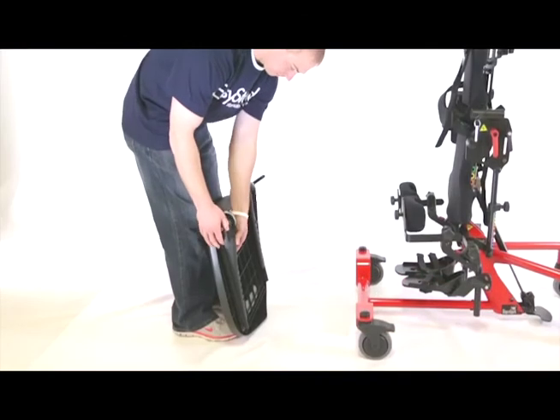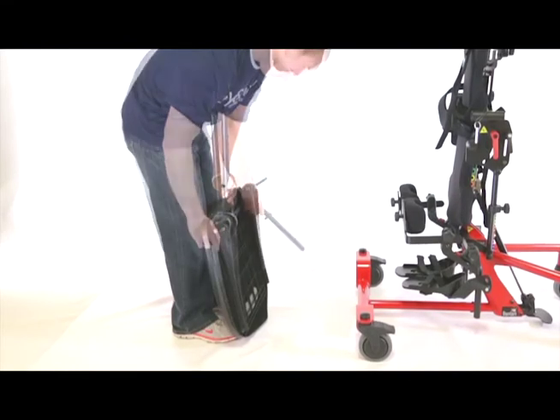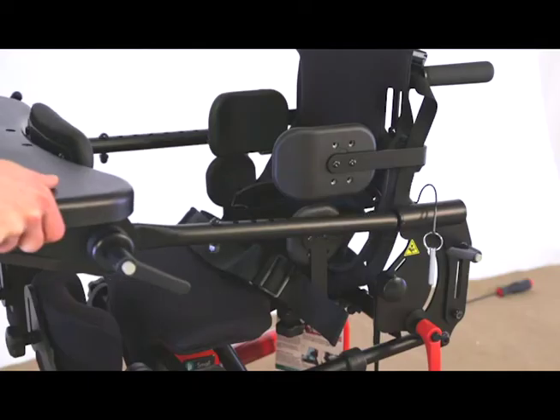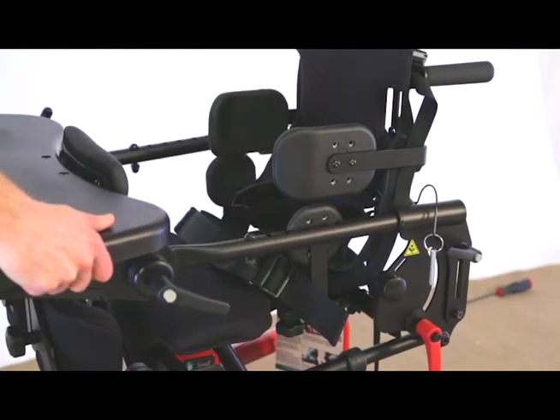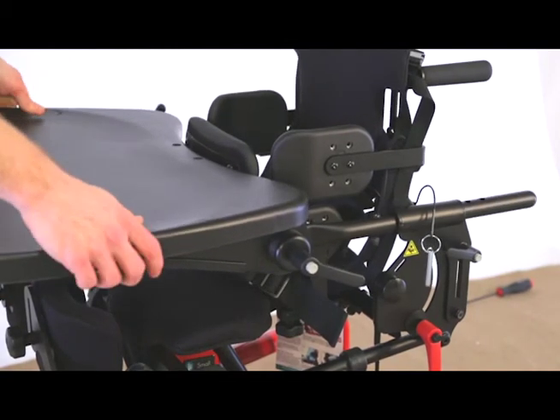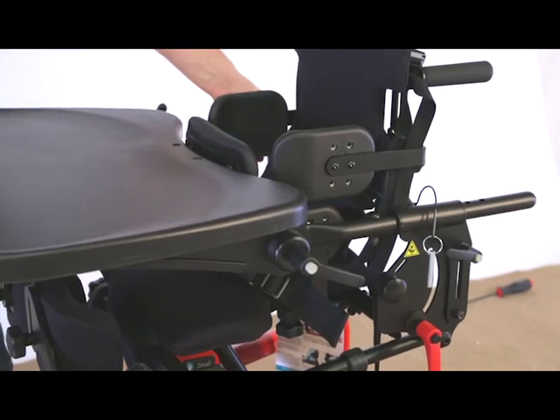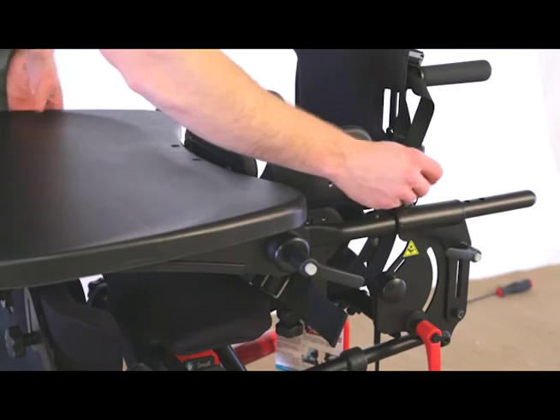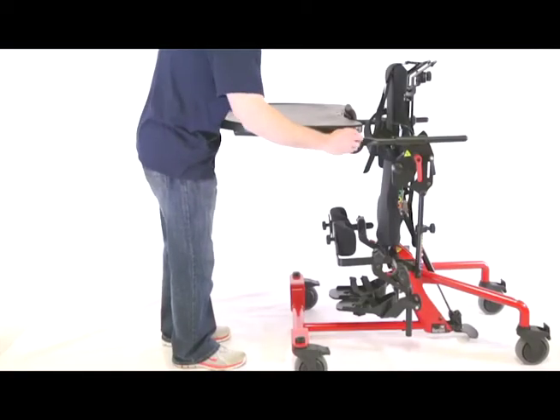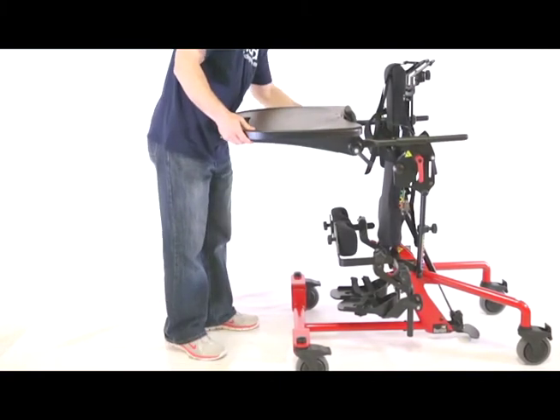If you ordered the optional shadow tray, loosen the ratchet handles on the side of the tray. Flip the arms up so they are lined up with the tray as shown, and tighten the ratchet handles. Insert the 2 tray arms into the tray bracket on the bottom of the tray. One of the arms is longer than the other for easier installation. The bolts on the arms are used as a stop for future reference. Place the quick release pin into the holes of the tray to secure into place. Caution: after placing the tray into position, ensure the ratchet handles on the side of the tray are tightened securely.